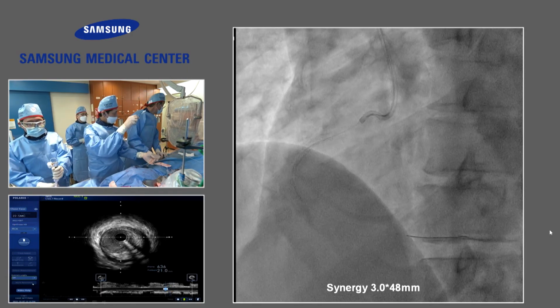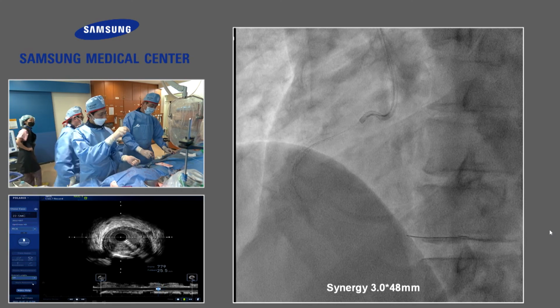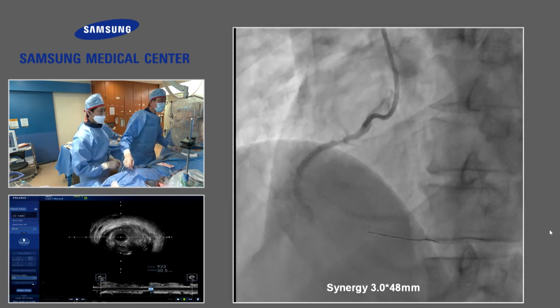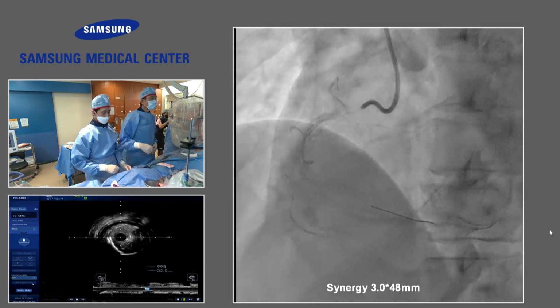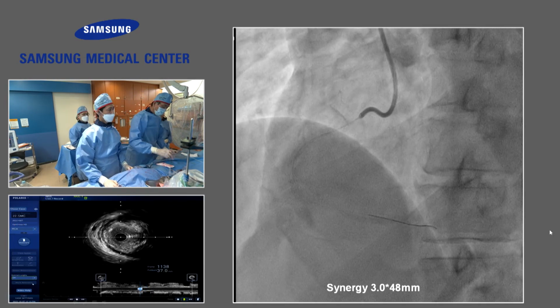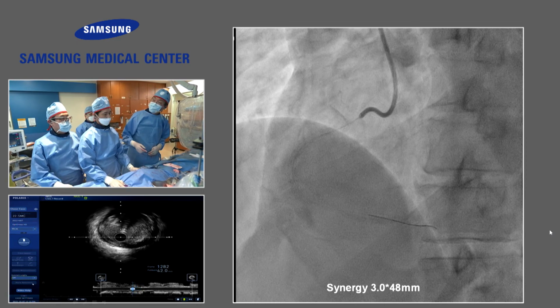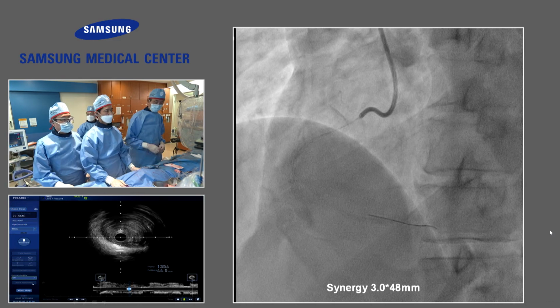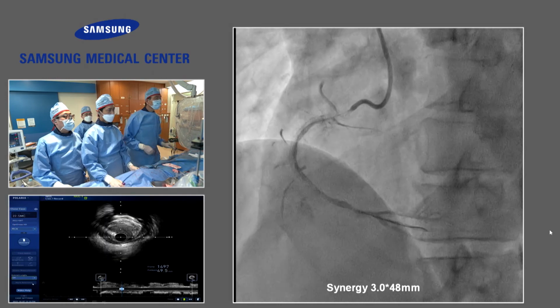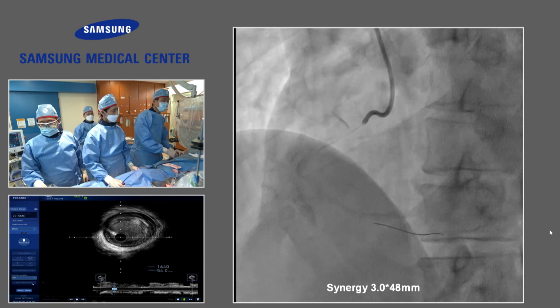Do you have chest pain? Patient, please look at us. Okay, are you all right? A little pain. Okay, fine. Good, 3.0 shows a sign of expansion. So actually, the pain, I don't like to go up to 16, 3.0. Yes, 16 is okay. The complaint of chest pain is a sign of vessel expansion.